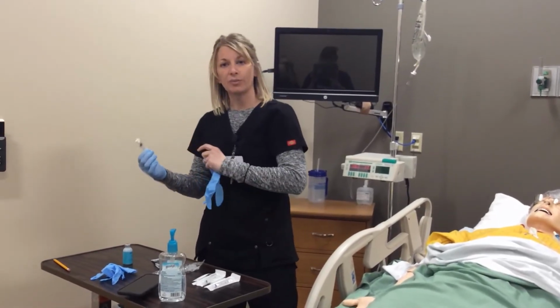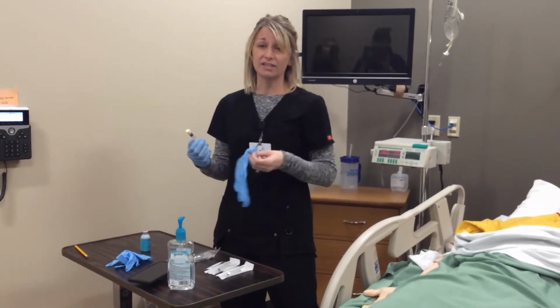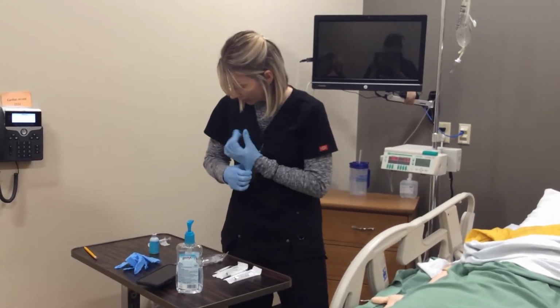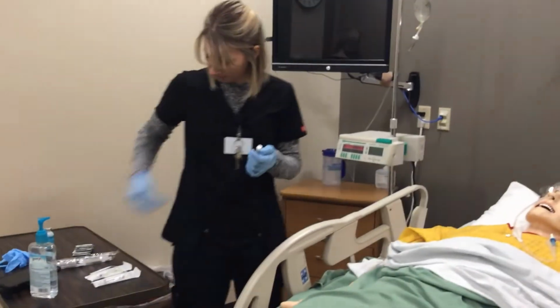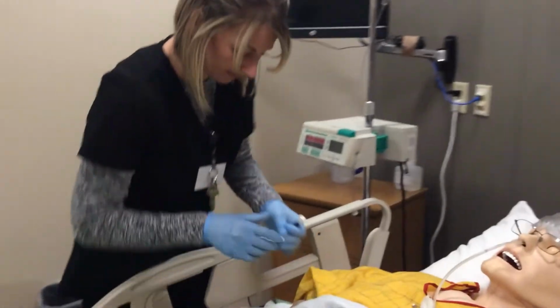Every 4 hours as needed for pain. I take a look at the last time he was given it. The new order, I look back, he hasn't been given any at all prior. So what I'm going to do is, I've already done my waste, so I know my dose is appropriate. I have my medication to show that I'm giving it. I'm going to go ahead and go over to my patient's IV site.